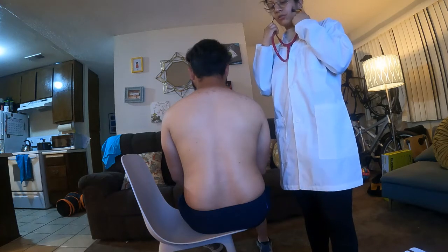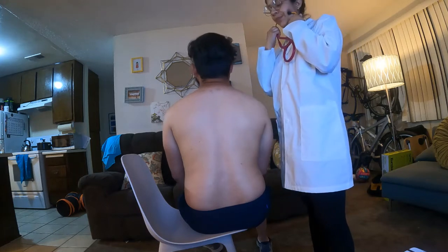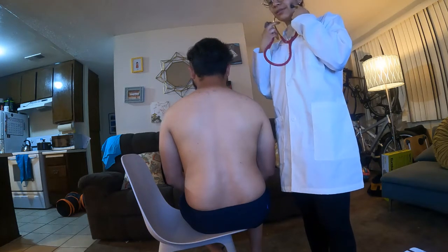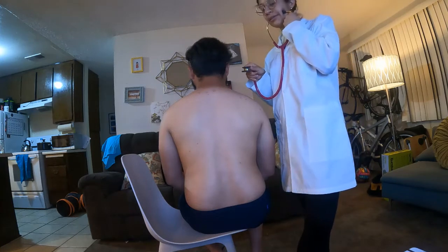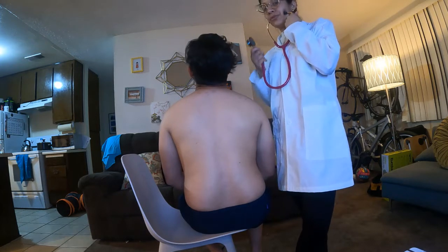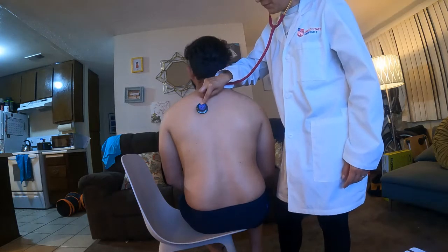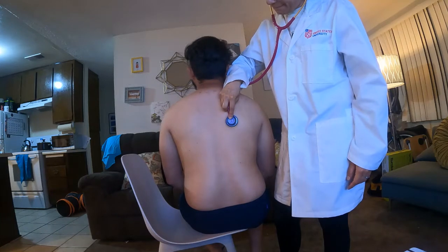And I can do a specialty test while I'm here, and this test is called bronchophony, and it's used to identify if there are any abnormalities in the lungs. I'm gonna ask the patient to say 99 every time I put my stethoscope on your back, and the word should be heard muffled. That will be a normal finding. Please say 99.